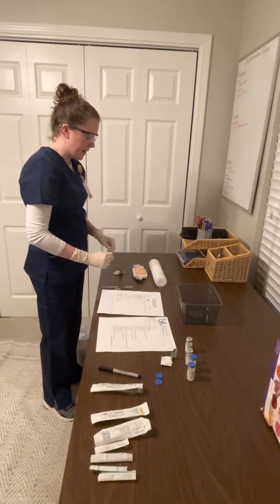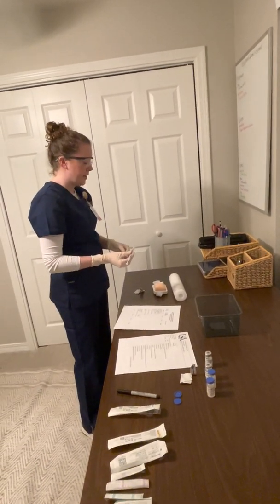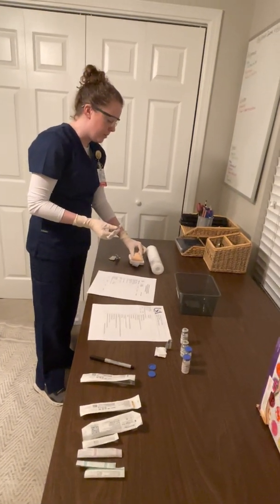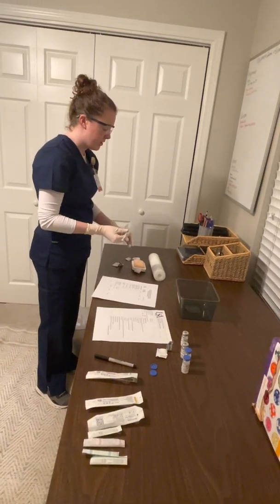So next I would go ahead and administer the medication. Since this is a subcutaneous injection and it's on the abdomen, I can pinch the skin 2 inches. So when doing this, I know that I can go at a 90-degree angle with my injection.